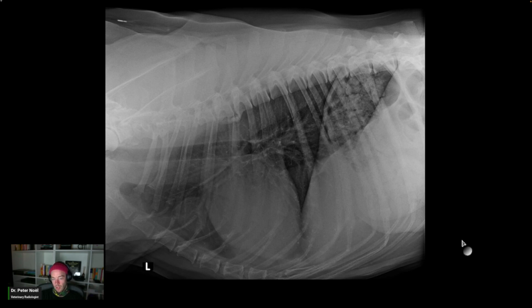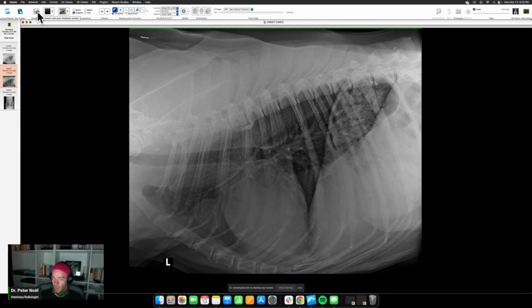But you're not wrong to CT it. And on a CT, you'll be able to confirm its location within the mediastinum. You'll be able to confirm that it's not invasive. You'll be able to confirm that it's thin-walled and fluid-filled and there's no enhancing tissue. And so then you go, oh, I bet this is an incidental cyst, and then you can leave it alone. Maybe you recheck it later on and further down the line, but you don't go nuts and stick needles in it and stuff. There you go. All right.